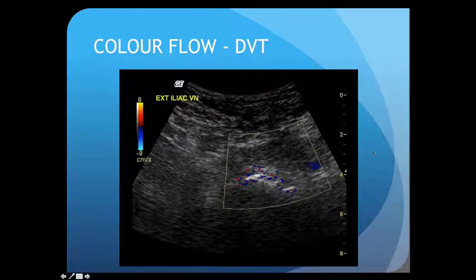Here, this is a patient who was actually transferred with a query ischemic leg. It was swollen, mottled and painful, and here we see in the region that we should be seeing the vein, first of all, there's no anechoic vessel. We can see the grey scale material here, and there is no flow in here. I've actually turned the gain up enough so I'm starting to get a little bit of artefact because my gain's so high, just to prove that it's not that it's undergained.